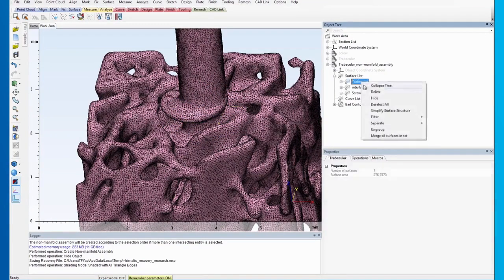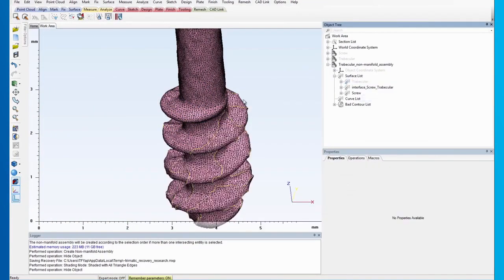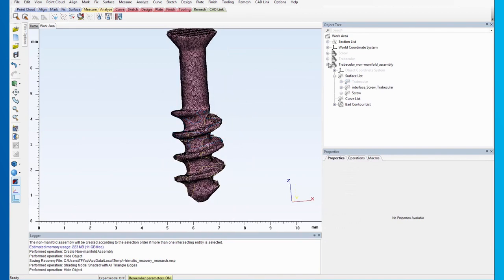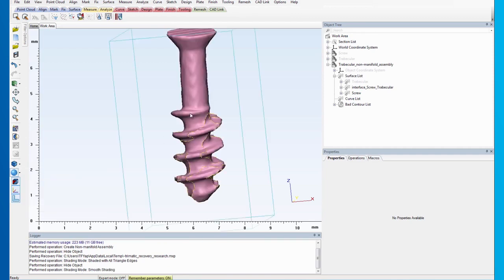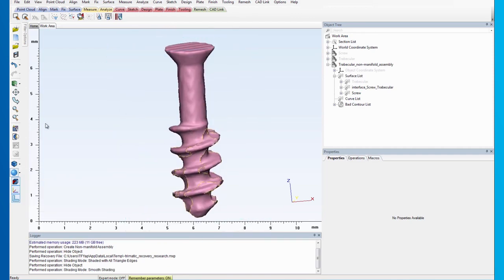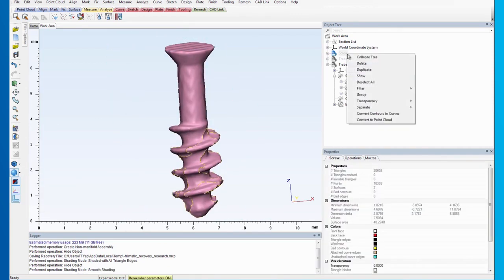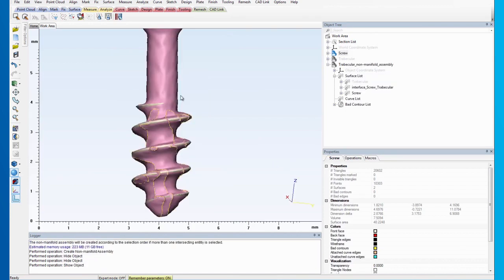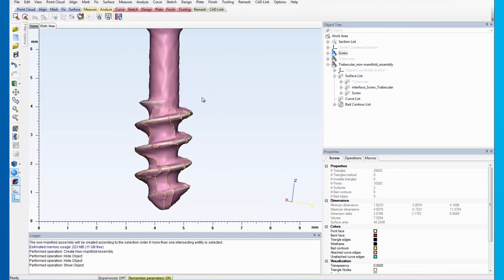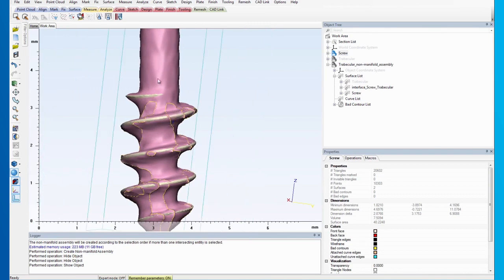Hide the trabecular surface set and visually compare the screw portion of the assembly to the original screw part. There is a noticeable difference between the two, so the next thing we need to do is improve the accuracy of the screw portion of the assembly.